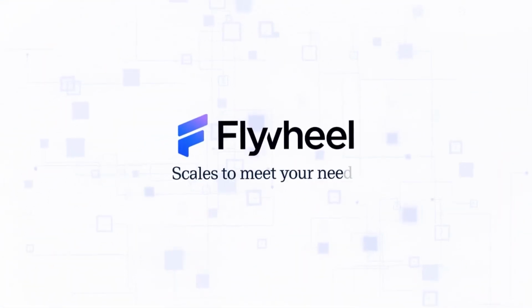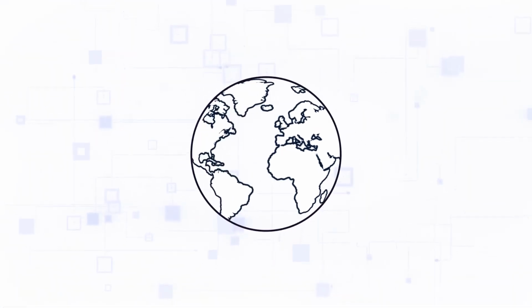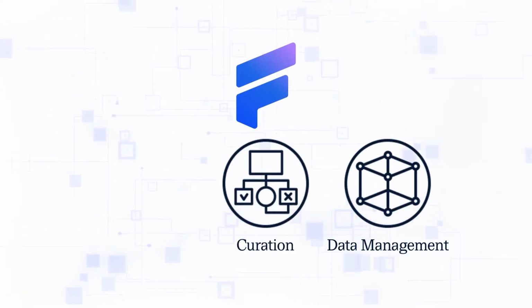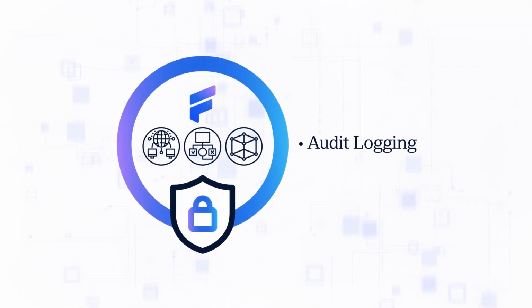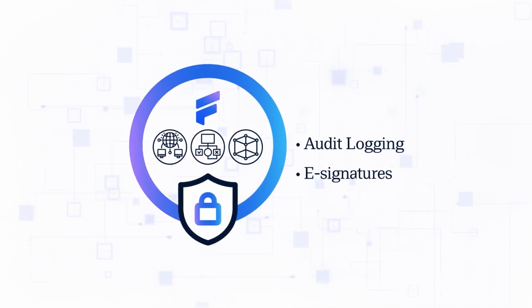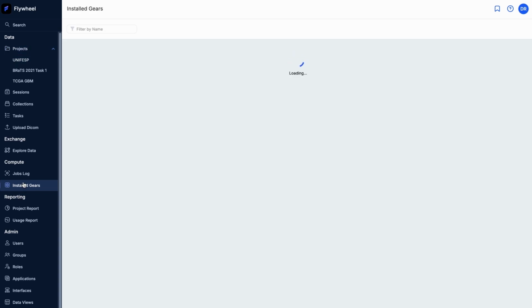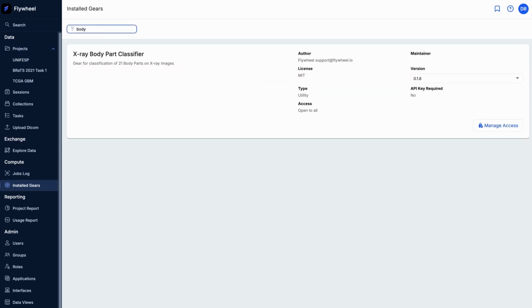Flywheel scales to meet your needs, whether managing data within your lab or collaborating globally. Our platform provides tools for data management, curation, and computation in a secure environment. With features like audit logging and e-signatures, you can trust Flywheel to meet the highest compliance standards. Flywheel enables secure collaboration through mechanisms to share golden data sets and developed algorithms.